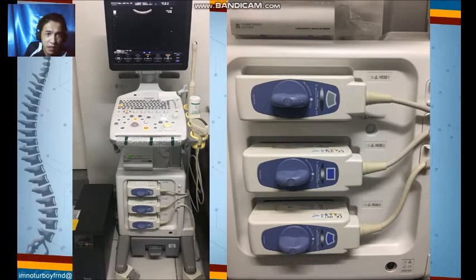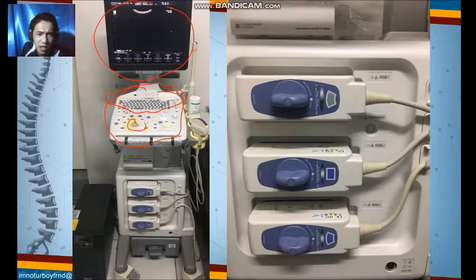We have here the monitor in which the image will be displayed, and then the keyboard, then the console, the whole of the console along with the keyboard, and the mouse, and then some of the annotations that will be displayed if ever the radiologist would want to display the annotations in the image.